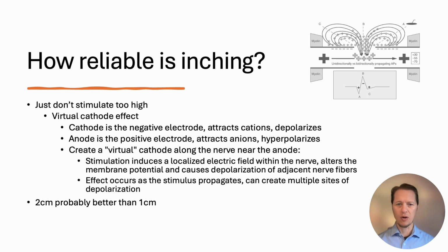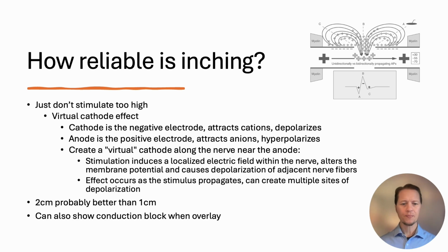2 centimeters is probably a little bit better than 1 centimeter, and don't go way super physiologic or supermax. Just get up to just barely a supermax stim, and then continue to inch or centimeter along the way.